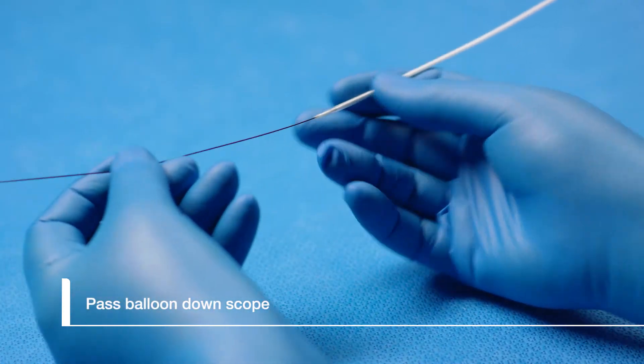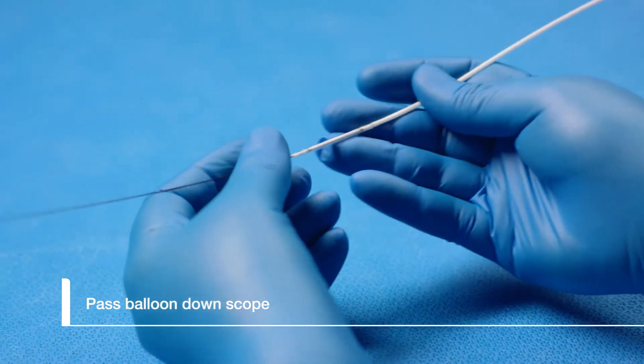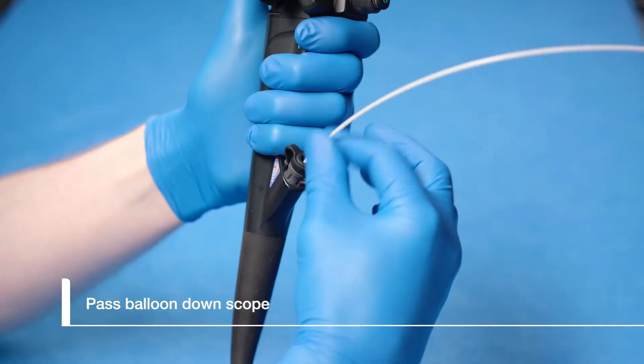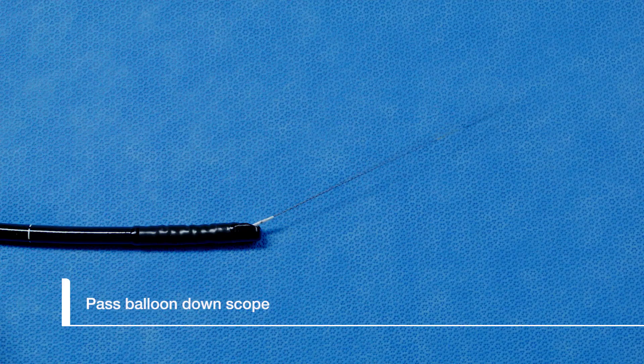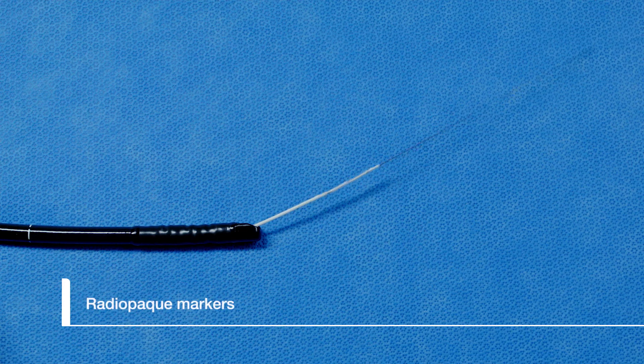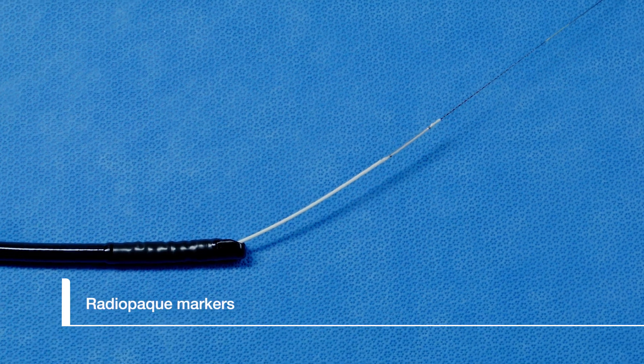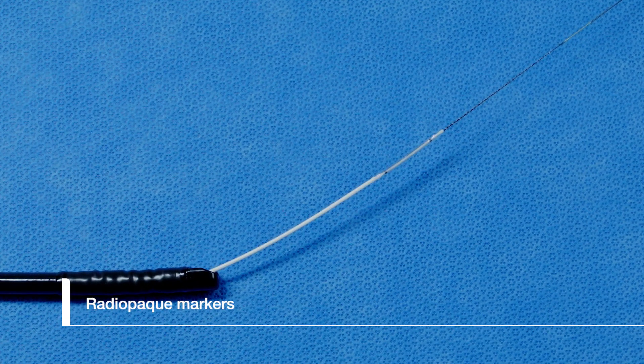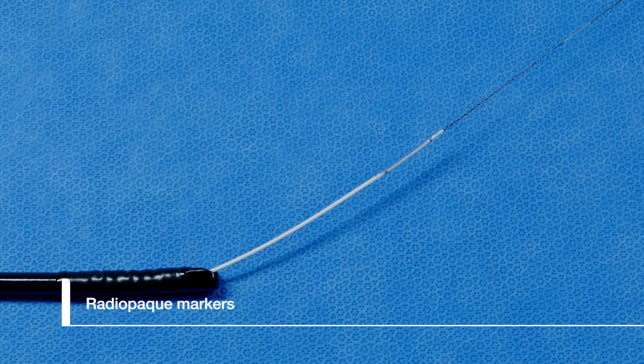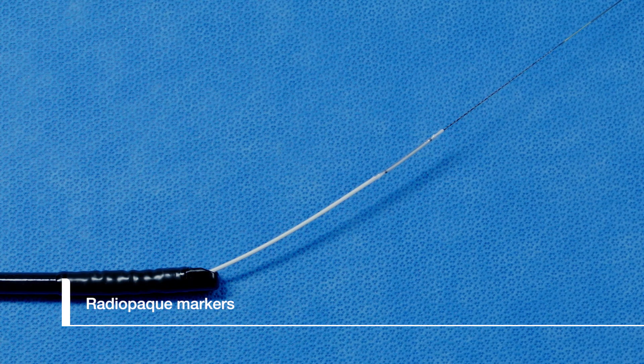Load the balloon over a .035 inch or smaller guide wire and down the scope into the patient. Once in the bile duct, radio opaque markers on the balloon will guide where the balloon is located. The markers should be placed distal and proximal to the stricture.